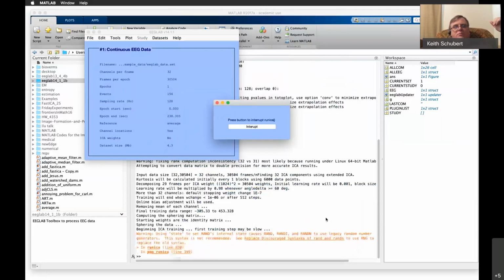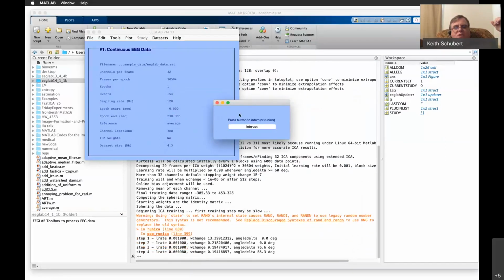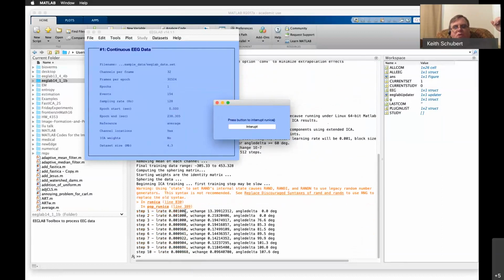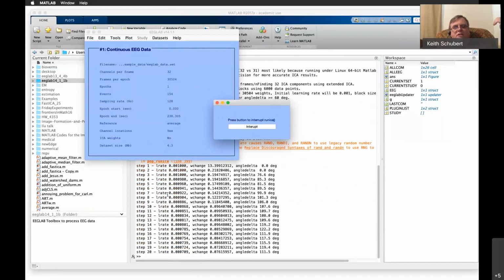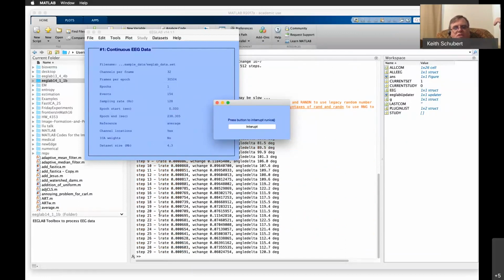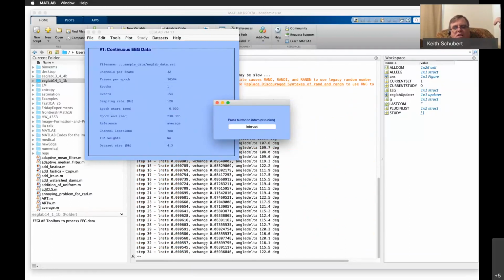We're at our time, so you can see just like you did before, because Run ICA tends to use Fast ICA as its algorithm, you can see it's doing all the different steps and calculating them. The mixing matrix W that it's trying to find will give you the maps of the head that we were showing.